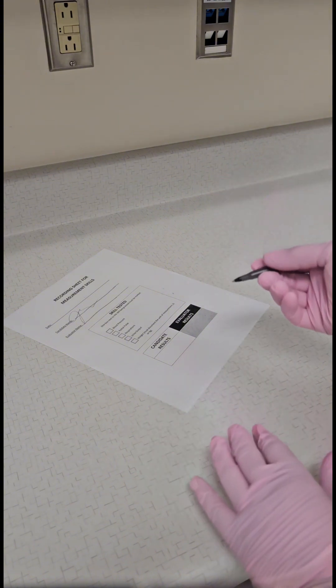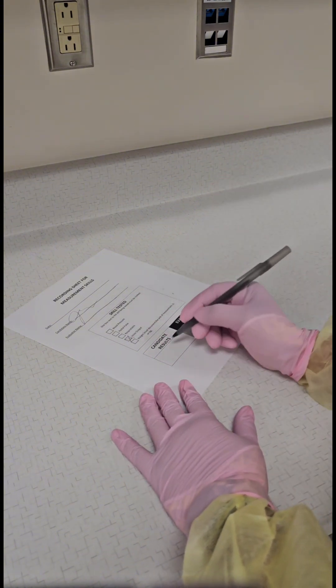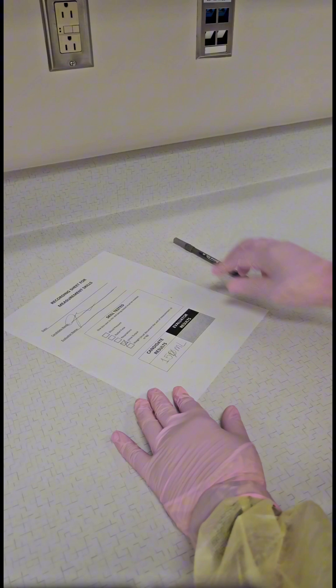Replace the graduate in storage or in the designated dirty area. Record your measurement in milliliters on the pre-signed recording sheet. You must come within plus or minus 25 milliliters of the evaluator's reading.